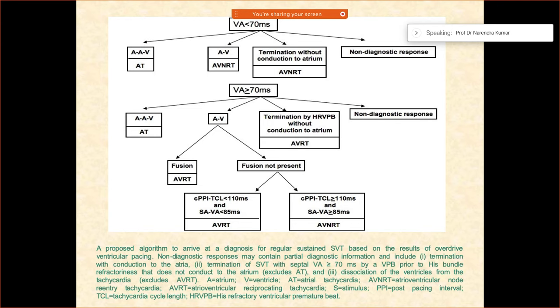Then, if the VA is less than 70 milliseconds, you try to do ventricular pacing. If you did ventricular pacing and you see AAV response, it is characteristic of atrial tachycardia. Similarly, if you get a A-V response, this is characteristic for typical AVNRT.